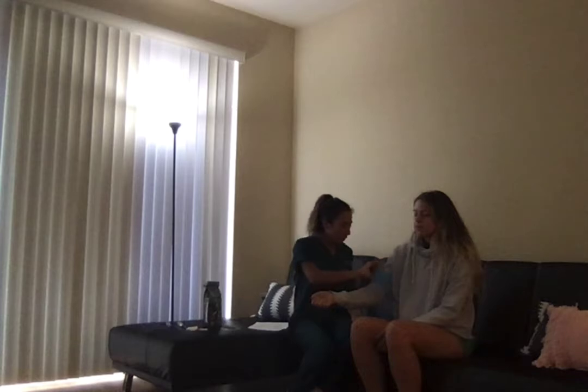So I'm going to pump it up, and then I'm going to slowly loosen the bulb on the blood pressure cuff, and the first sound that I hear will be the systolic, and then when that sound disappears, I will note that number as the diastolic. So the normal finding is that it's 120/80 or 90/60, so that is good.